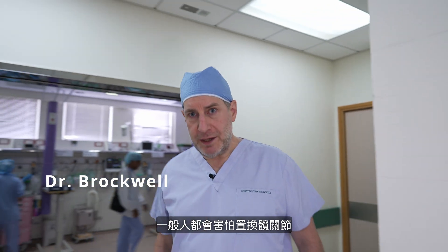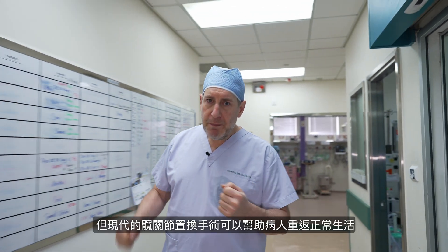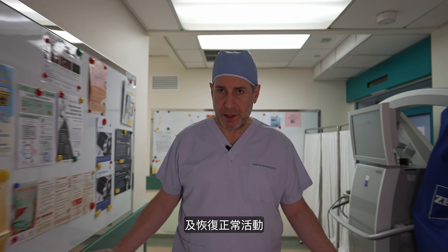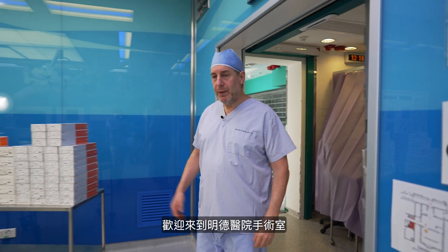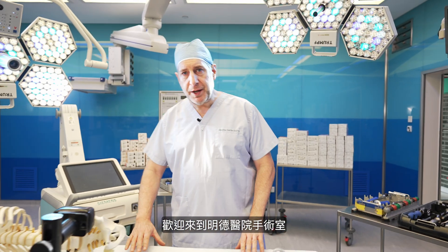People are afraid of hip replacements, naturally. But modern hip replacements allow people to return to normal life, normal function. I want to show you how we achieve that. Welcome to the Matilda International Hospital Operating Theatres.